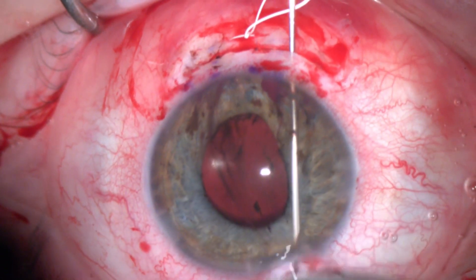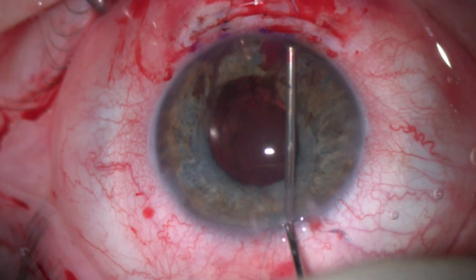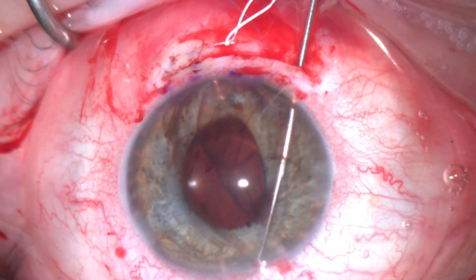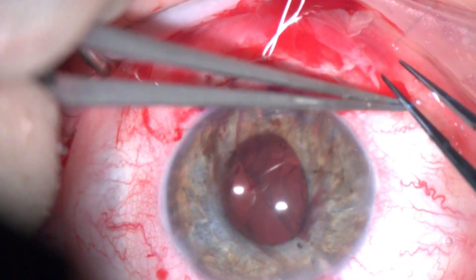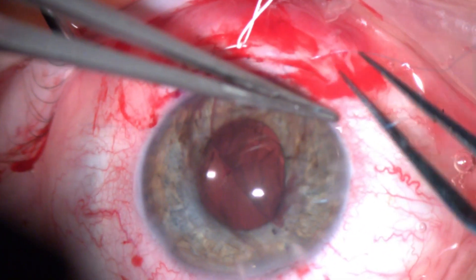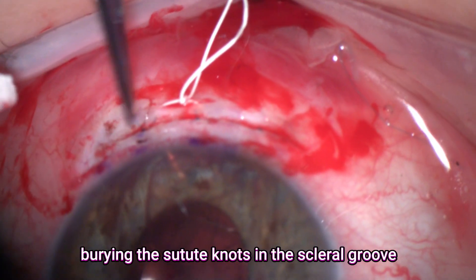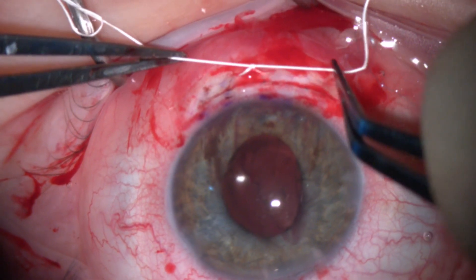One important tip here is to try to make the sutures slightly larger from the scleral side just to follow the configuration of the iris and prevent any curling of the iris at the angle. Retrieving the last suture and securing it in place. Then I'll secure the last suture. The iris now has a good cosmetic appearance following repair with three mattress sutures. I'll gently bury these knots in the groove to avoid them causing any irritation following the surgery.